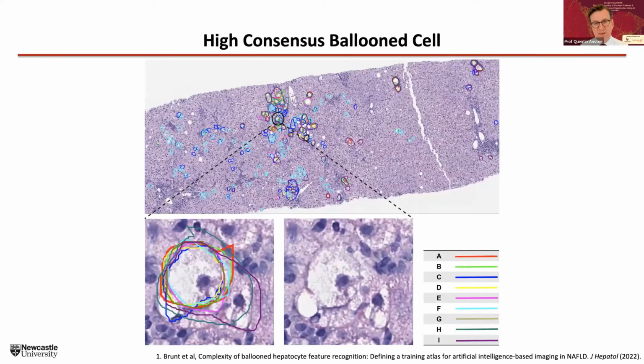And in fact, when we considered over the 80,000 cells that were identified or looked at across these 10 images, there were about 1,180 cells that any one pathologist considered to be ballooned. But what I'm showing you here is the single cell out of those 80,000 that were examined, 1,100 that were considered to be ballooned. This is the single cell where all 9 pathologists agreed that ballooning was present. So this is, I think, as much as we can describe as the most classic image of a balloon cell that there is.